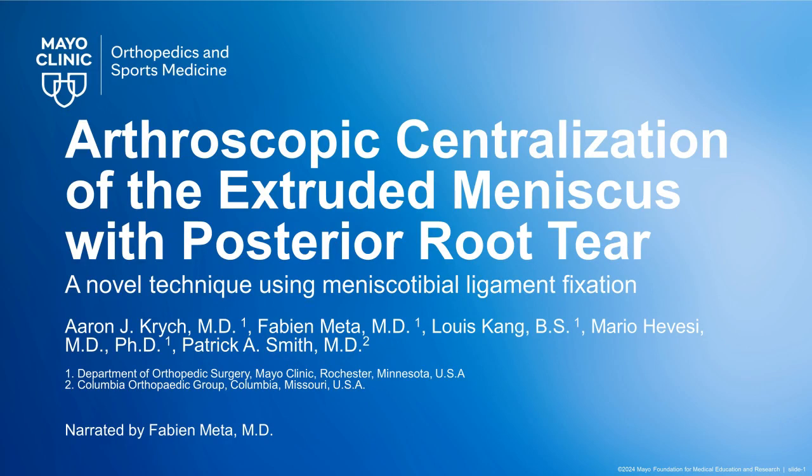This video will demonstrate a novel technique for meniscus centralization that promotes more native meniscus motion with fixation of the meniscotibial ligaments.